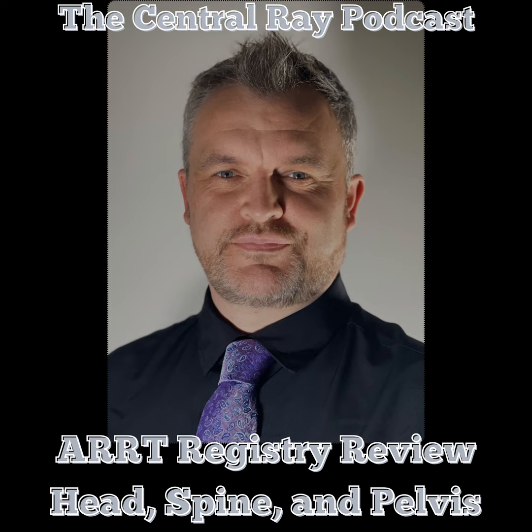Femoral neck fractures are common in elderly patients with osteoporosis. Avascular necrosis of the femoral head appears as increased radiographic density and collapse. In children, Legg-Calvé-Perthes disease is avascular necrosis of the femoral head. And that brings us to the end of our pelvis review.